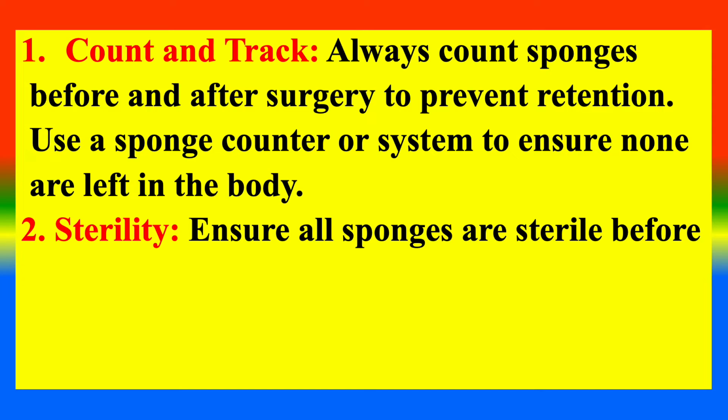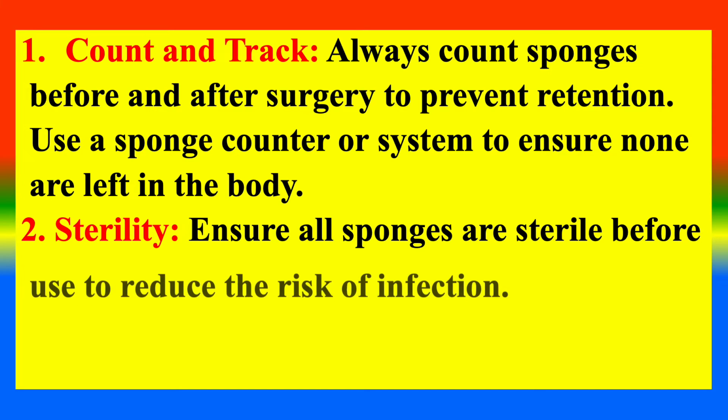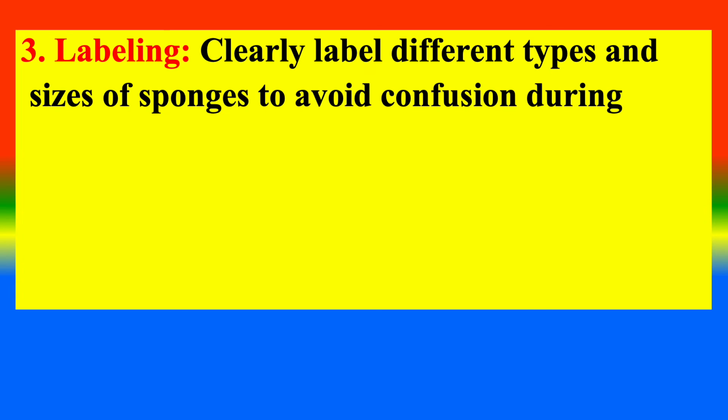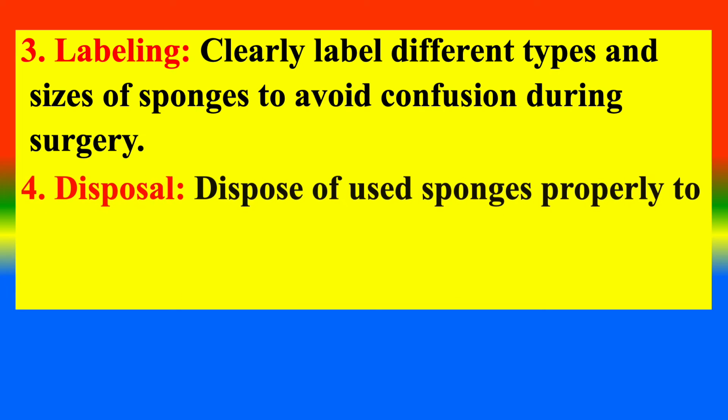Sterility, ensure all sponges are sterile before use to reduce the risk of infection. 3. Labeling, clearly label different types and sizes of sponges to avoid confusion during surgery.